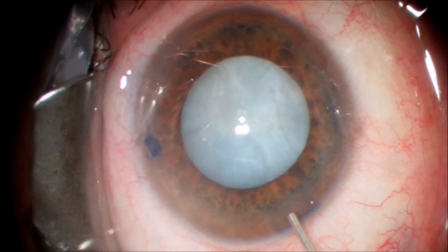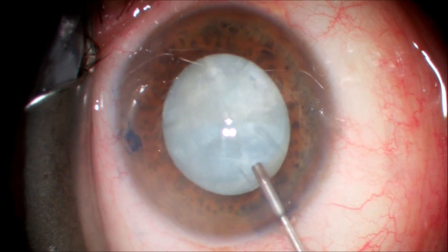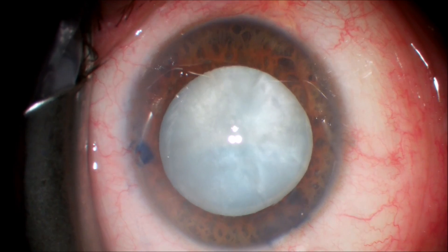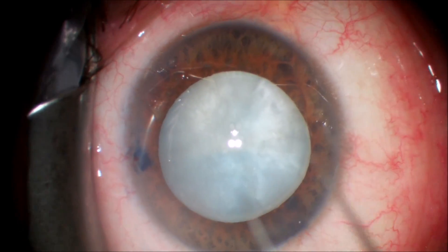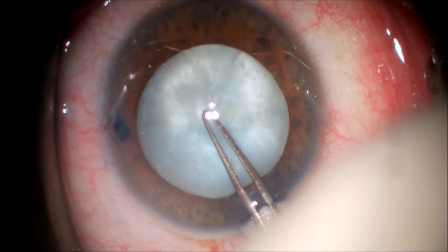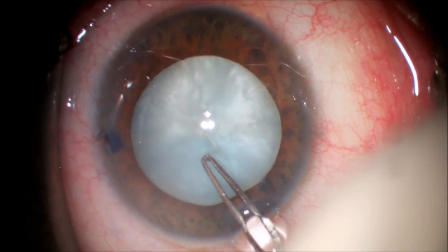We're going to fill the anterior chamber fully with a dispersive viscoelastic — in this case we're using Endocoat. This will protect the inside layer of the cornea, the endothelium, and also push back the anterior capsule to flatten it out. We're going to use our typical capsulorhexis forcep to make a puncture in the anterior capsule.